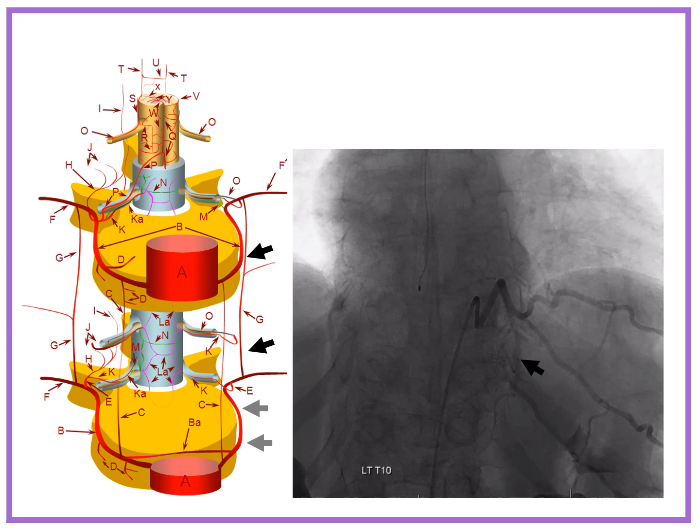And likewise, as you can see, this pretransverse anastomosis is located distal to, say, the letter E or the letter O, which is where the radiculomedullary or the radiculodural or the radiculopial arteries might come from. It's arising distal, typically from what's called the ventral and the dorsal divisions of the segmental artery. And so now you start to wonder, where is the anterior spinal artery? Well, as you can imagine, it's coming from the levels we didn't inject. And so here we go.